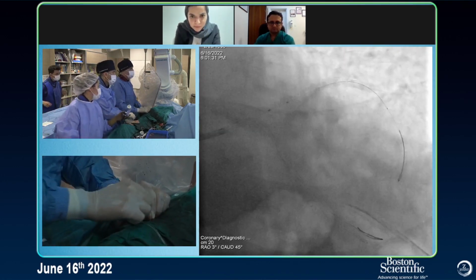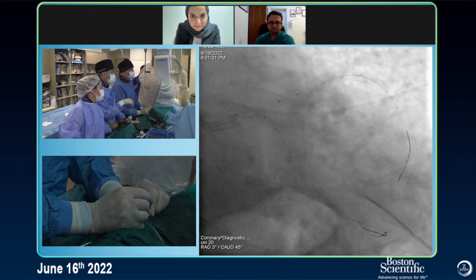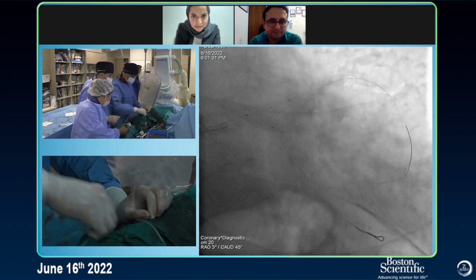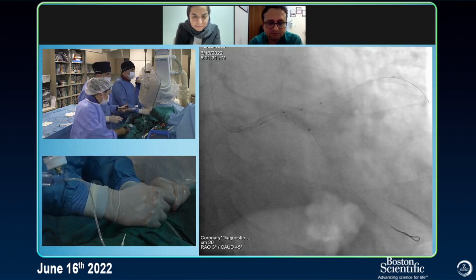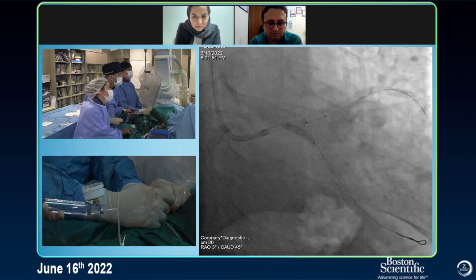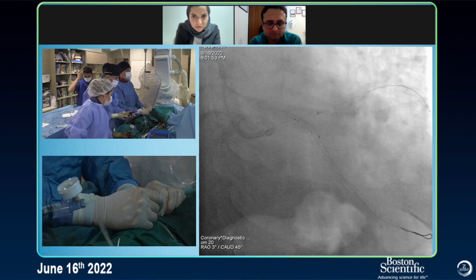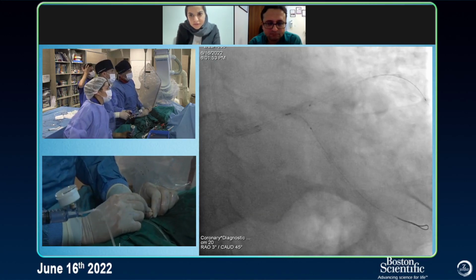This is for circ. So 3.5 in the circ. Yes, good, good. Okay, 14. Taşıyorum. Bunu da şişe abi. 14. Şişiyorum. 14. Down. Go up 20. 14, 16, 18, 20. Down.